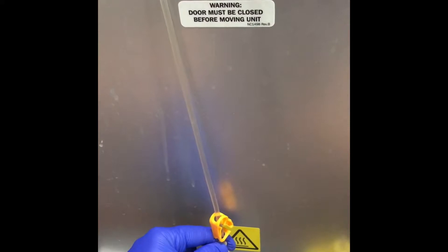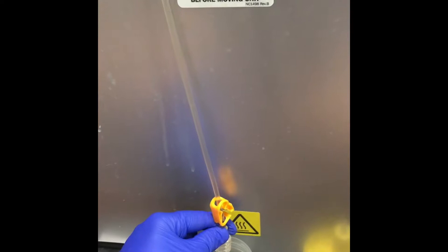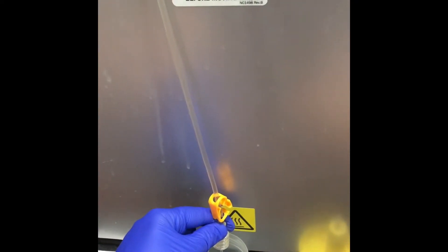This is done every time I make a new batch. I get two treatments per batch and I do this before starting the new batch.